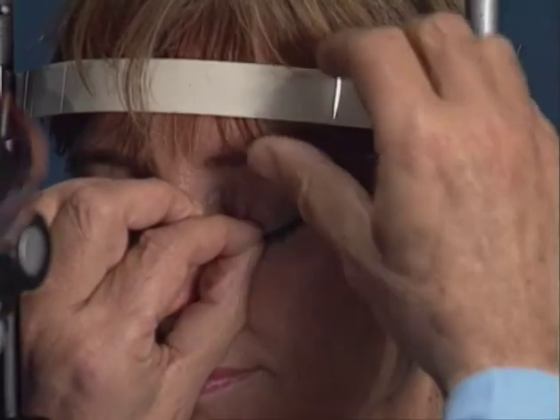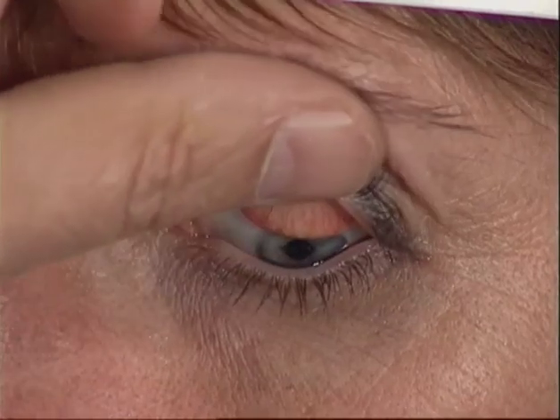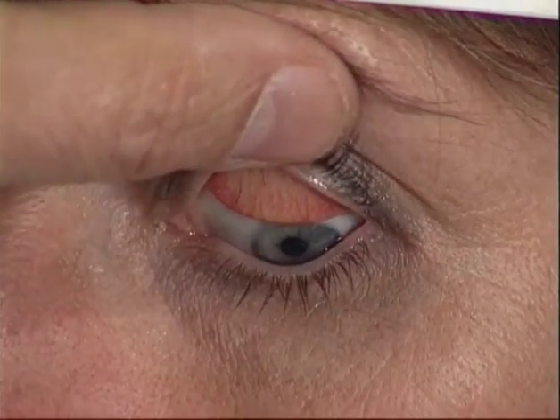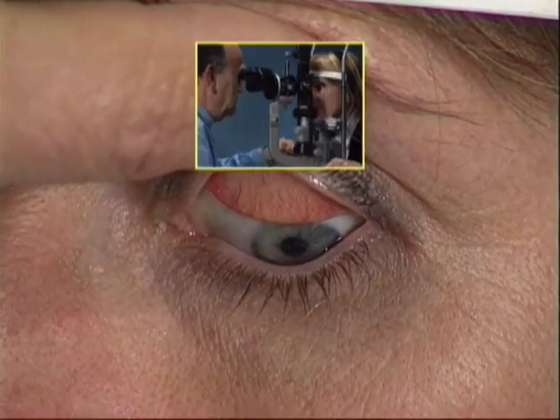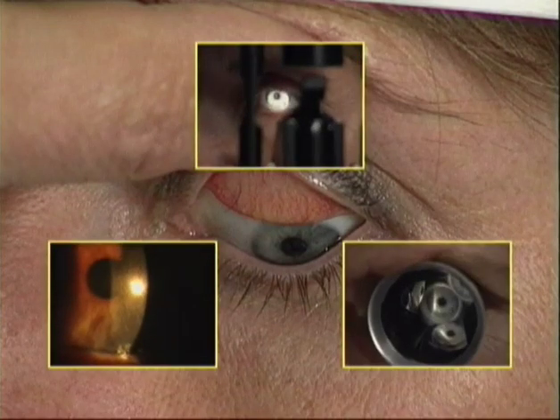This is the end of Biomicroscopy of the Tarsal Conjunctiva, a means for the diagnosis of external diseases. It is part of a series on biomicroscopy of the eye, in which the specific techniques for each part of the globe are explained.